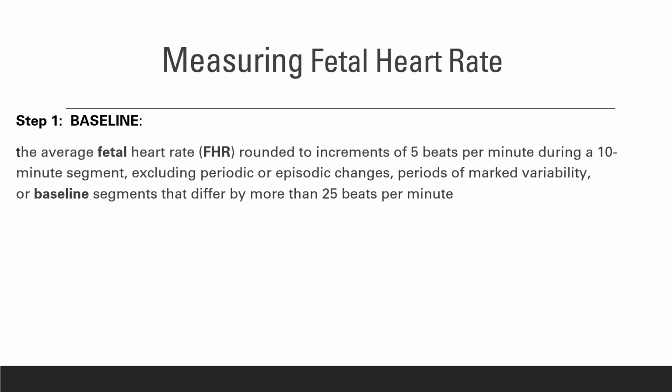Accelerations are the third step. You need to determine if there are any positive or negative accelerations. An acceleration is an increase of the fetal heart rate from the baseline to at least 15 beats above the baseline for at least 15 seconds long. This is for babies that are 32 weeks gestation or above.